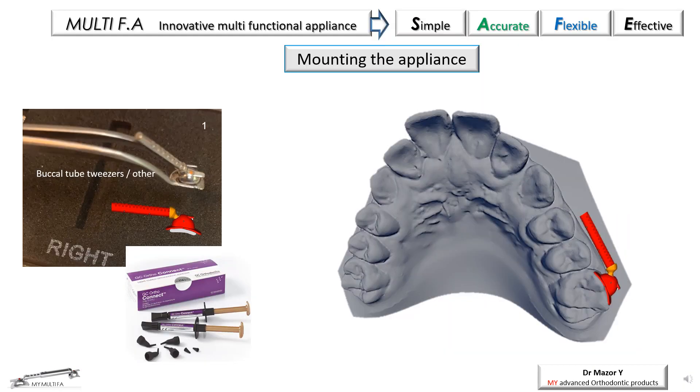The mounting procedure of the appliance is simple and easy, and it is similar to tube or bracket bonding. The tooth surface preparation includes initial cleaning with a prophylaxis brush, etching for at least 20 seconds, washing and drying well. The use of the new generation of bonding materials, such as the GC OrthoConnect, is highly recommended due to the excellent bonding strength and the elimination of the need for an extra step of using a primer.